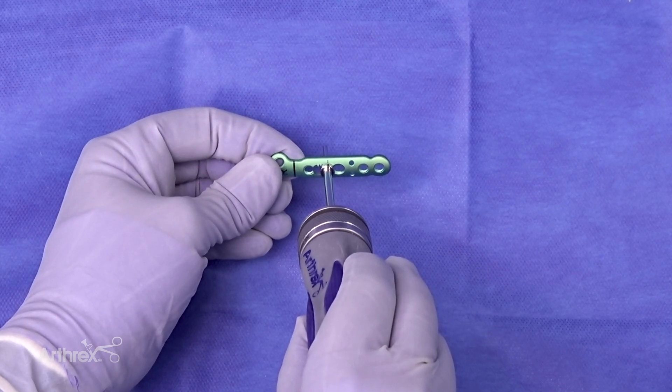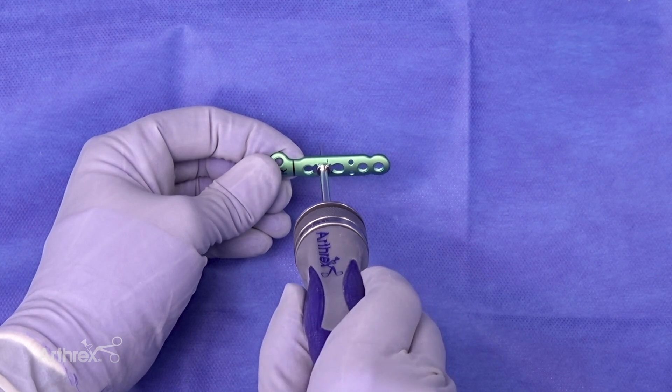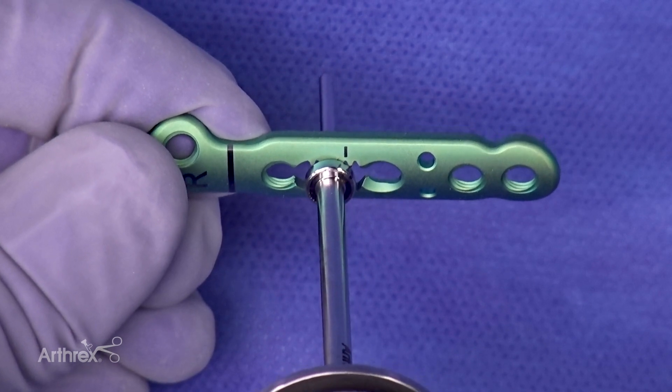Seen here is the newly designed compression mechanism demonstrating compression with clockwise rotation. It is important when engaging compression to utilize no more than two-finger tightness with rotation.